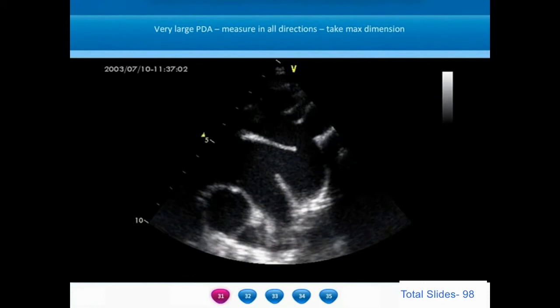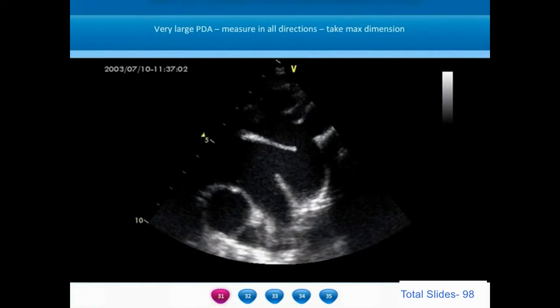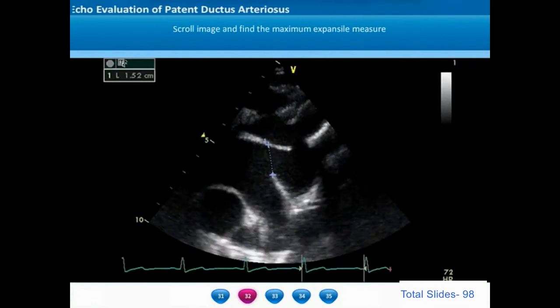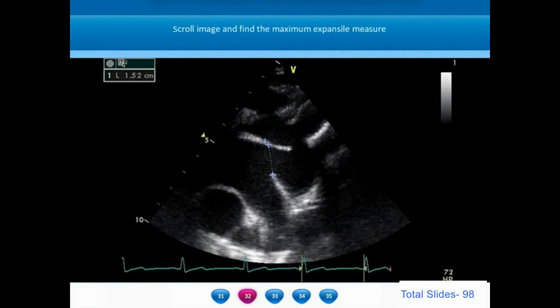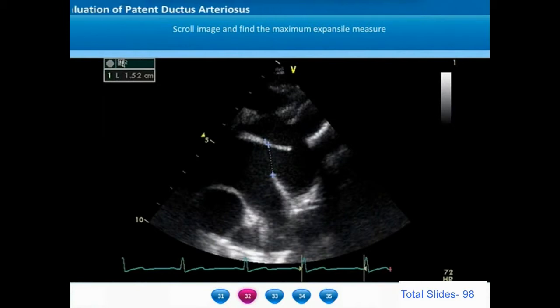Some ductus may be very large — the dimension may even be larger than the isthmus of the aorta. We need to measure the ductus in all dimensions and all directions, including the parasternal ductal view and the suprasternal ductal view, and take the maximum dimension to decide on the size of the device to be used. The ductus is an expansile structure, so we need to scroll through the cardiac cycle to find the maximum expansile diameter. The maximal ductal diameter will be seen in end-systole, as identified in the frame corresponding to the T-wave on the ECG.